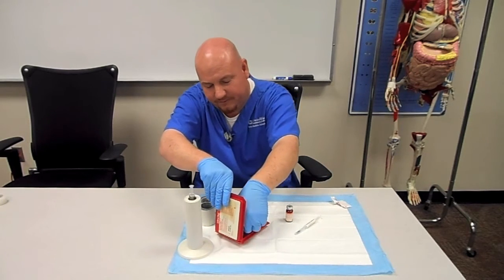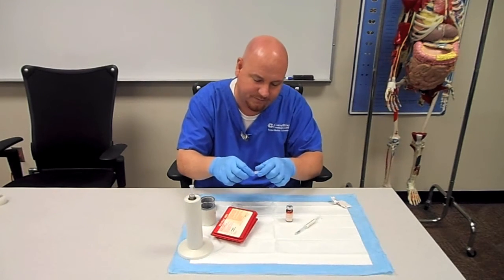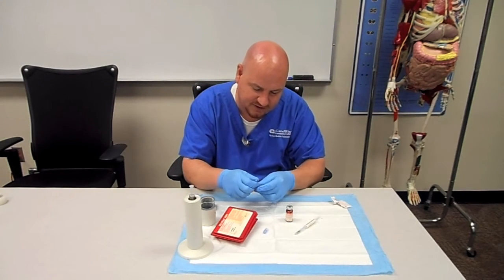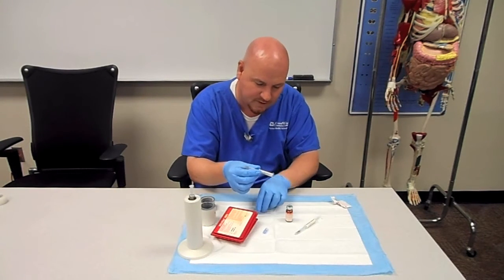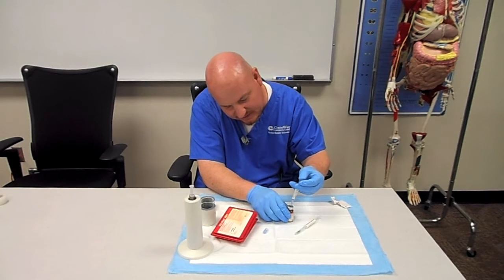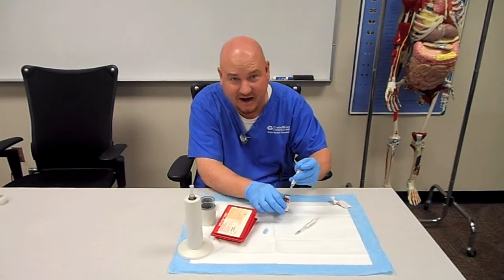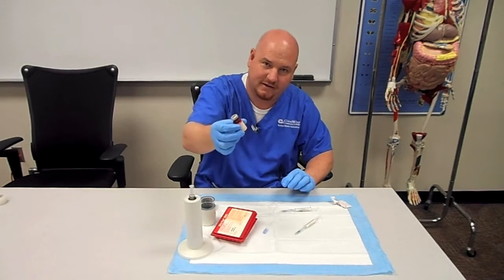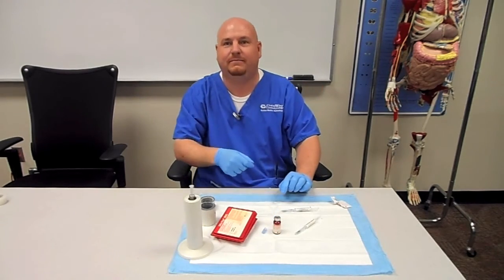The same thing now with syringe 2. Put the needle onto the syringe and pop the cap so it's loose. Pusher stick is ready. Puncture the vial, inject the contents of syringe 2, twist it, pull the needle up just a tad, pull out the extra air. Invert the vial a few times. It is still not radioactive at this point.